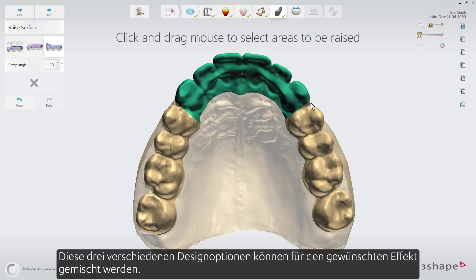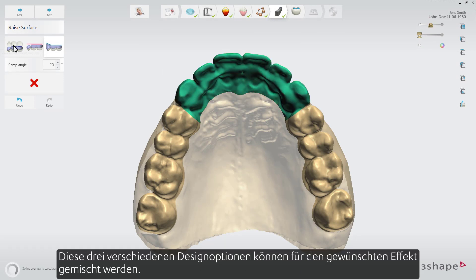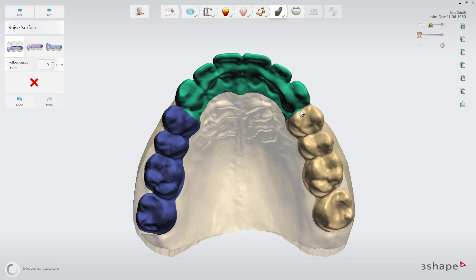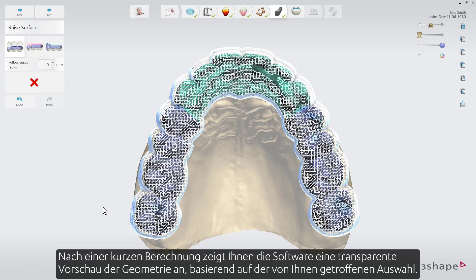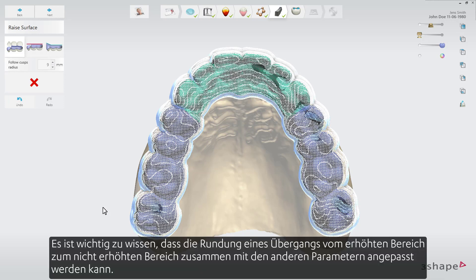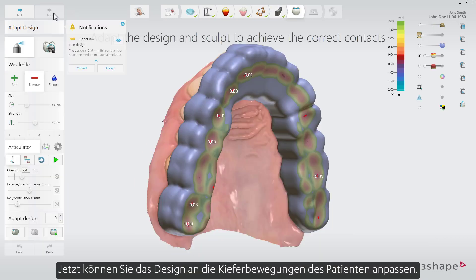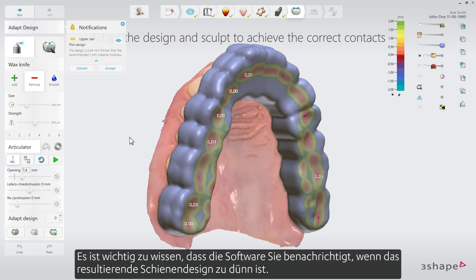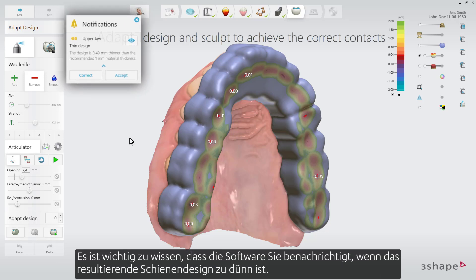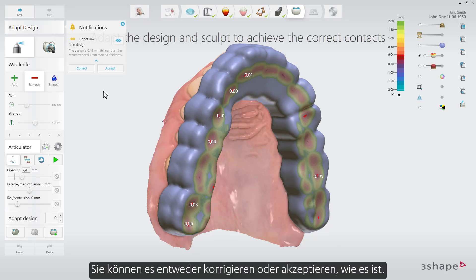These three different raise methods can be mixed for the exact desired effect. After a short calculation, the software will present a transparent preview of the geometry based on the selection you've made. The rounding of a transition from the raised area to the non-raised area can be adjusted along with the other parameters. Now you are ready to adapt the design based on the excursions of the patient's jaw. It's worth knowing that the software will notify you if the resulting splint design is too thin — you can either correct it or accept it as is.